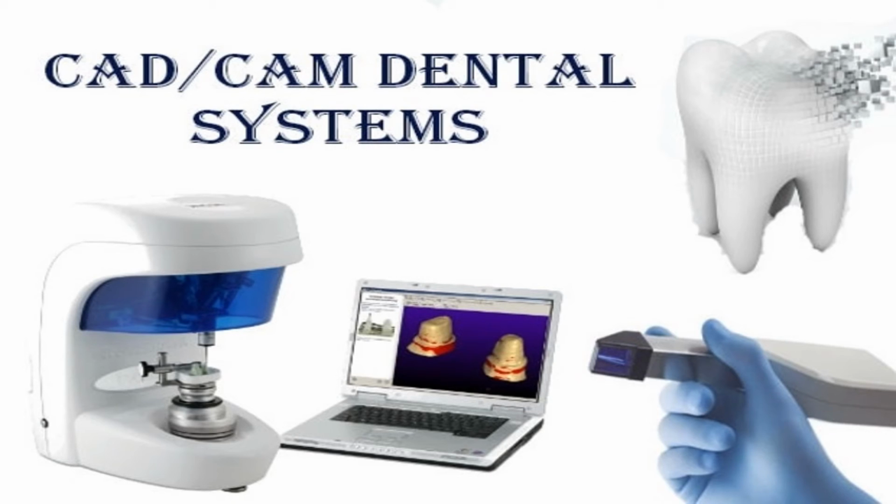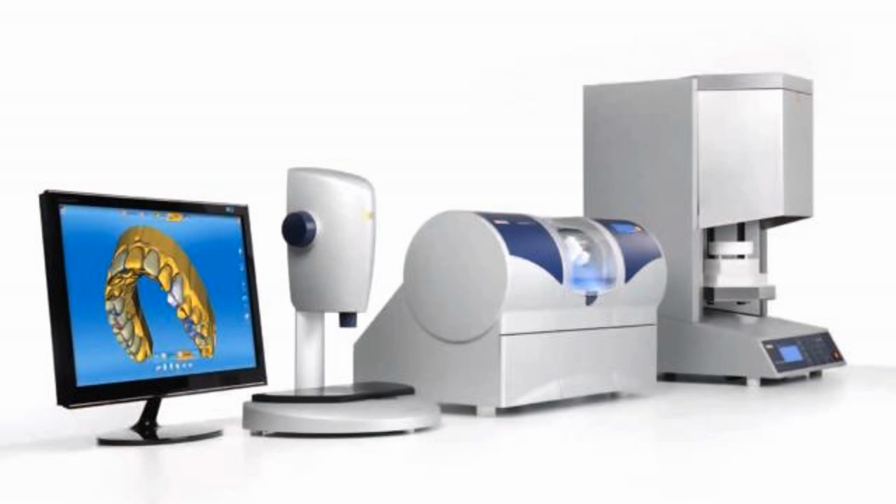CAD refers to computer-aided design, CAM refers to computer-aided manufacturing. All CAD/CAM systems consist of a digitization scanner that transforms geometry into digital data that can be processed by the computer. CAD/CAM systems process data, and depending on the application, they produce the data set for the product to be fabricated.